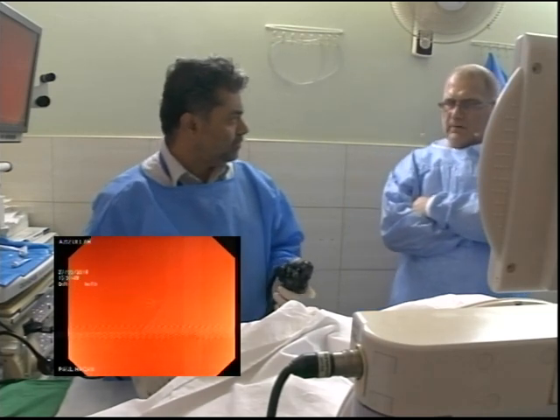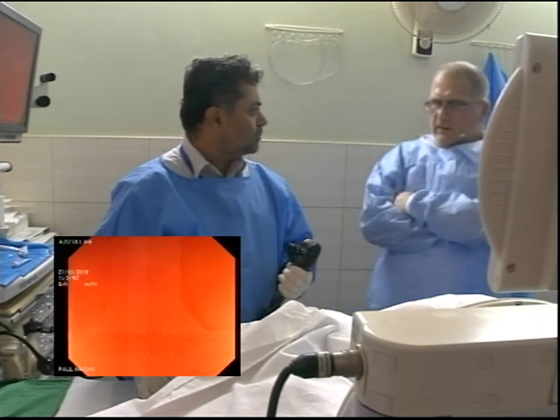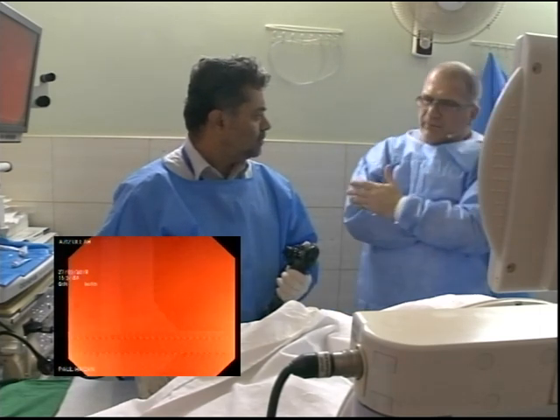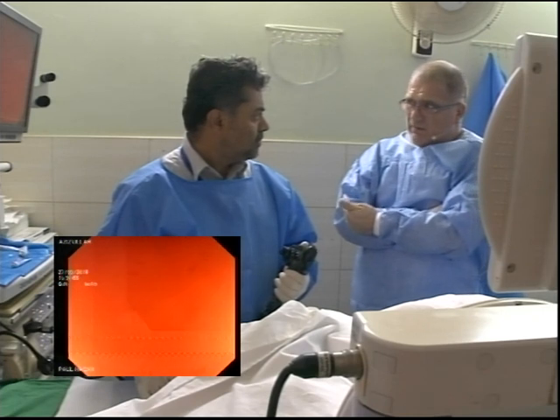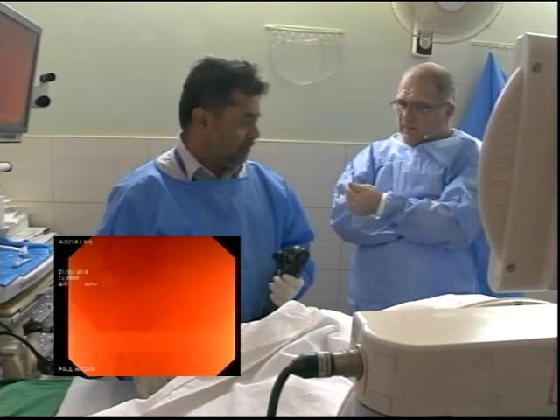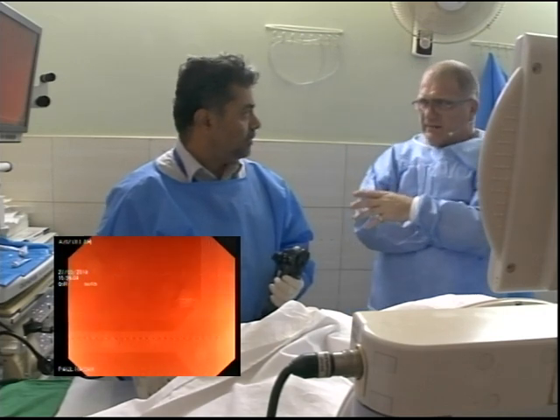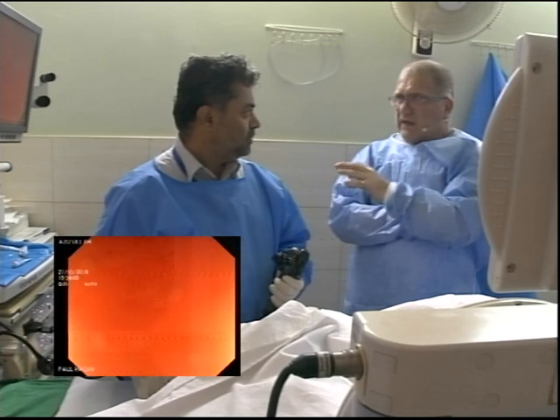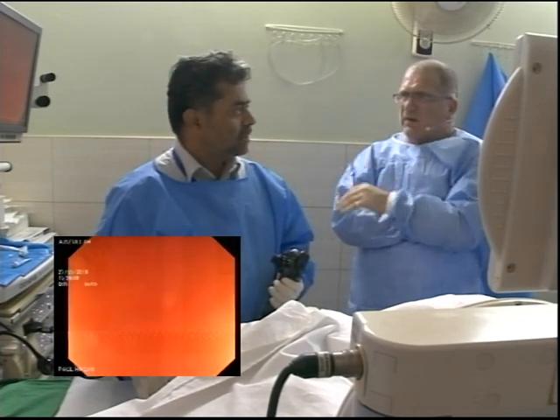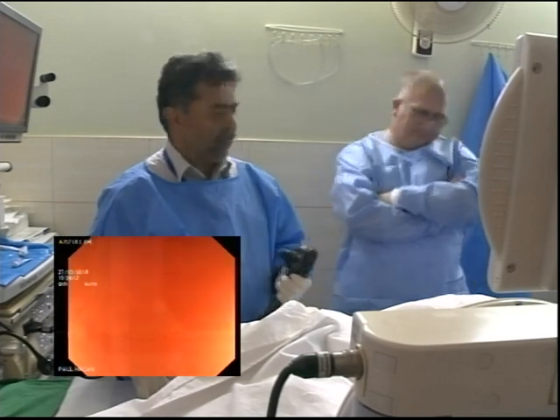So what have we got you to do, myself and the other trainer? So what we've done principally is that we've got you to slow down. Yes, slow down. So, biggest learning point, slow down. Take your time. Small amount of insufflation and advance. So, the three key points: slow down, less air, and less movement.